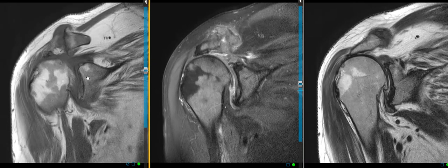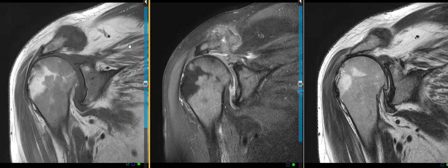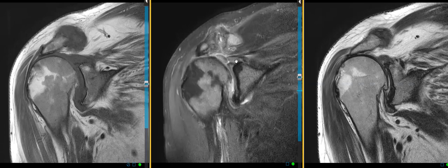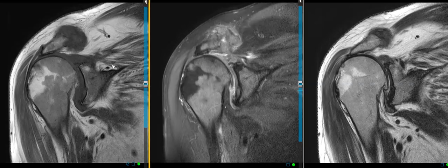This is a long-standing tear because we see the fatty atrophy. The patient also had a tear of the superior labrum, a tear of the inferior labrum, and a ruptured biceps tendon — so lots of pathology. But there's one other finding, and it's the main reason for this video: the marrow pattern.